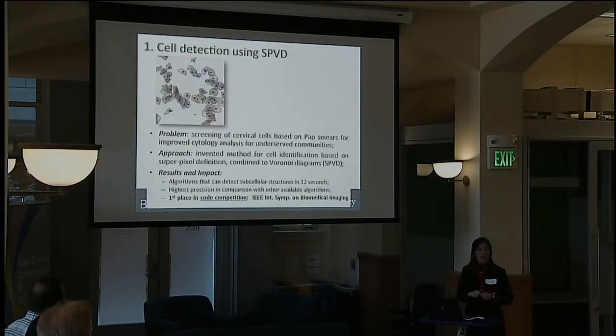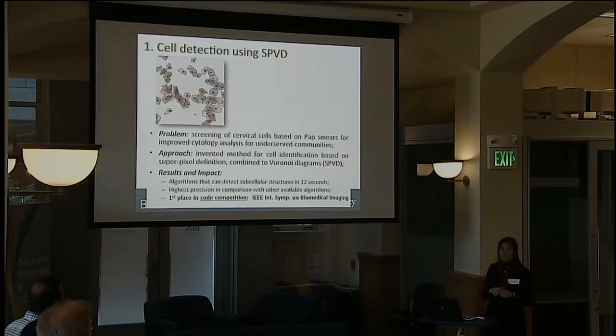So what have we done in the past? We worked with simulated cells as well as real cells. Most of them were simulated because we needed the ground truth. For what? To screen these cells. Part of this screening is to identify where the cell is, right? And which are the parts of the cell.